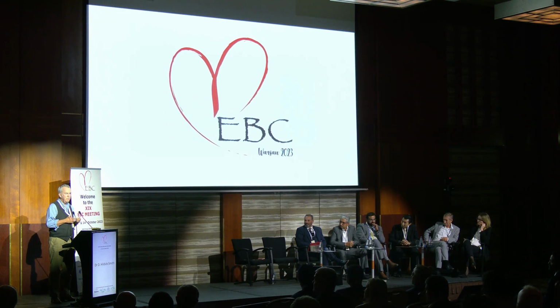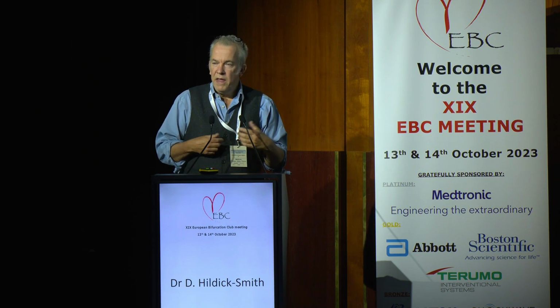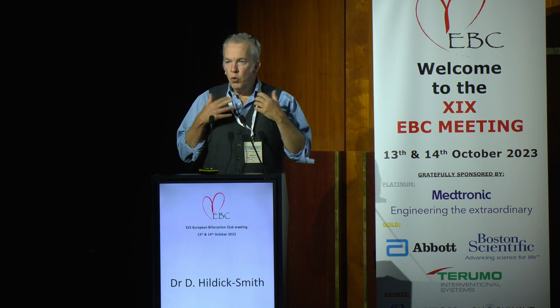And of course, intuitively, if you could make sure that you didn't get acute vessel closure, and if you could make sure that you didn't get restenosis in the vessel, doing a procedure where you actually don't leave a permanent implant is an excellent intuitive strategy, just as, and this is a drum I have been banging for a long time, just as using one stent rather than two, for example, could potentially be a superior outcome for the patient.